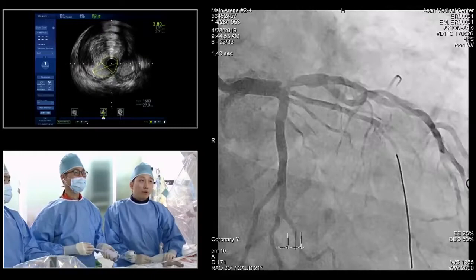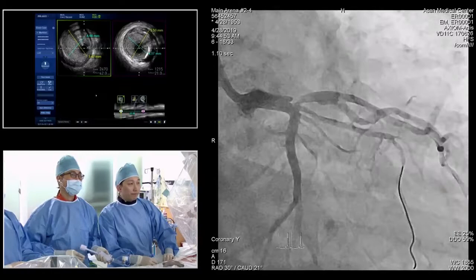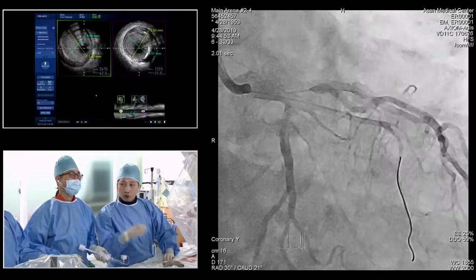So Greg, there's one other point. Yes. Despite what it looks like angiographically, that carina, the flow divider, is still disease-free. Right. I mean, it looks like there's disease in the inferior aspect of the LAD, but it's not. Right. Can you show the carina?